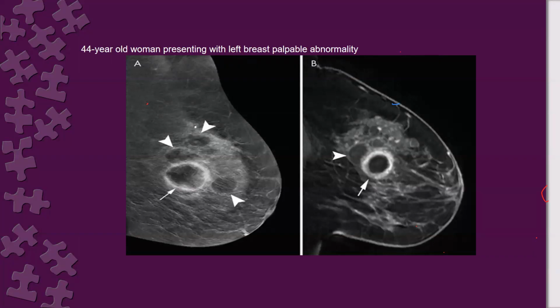This is MRI. Who said MRI? Yes, it's MRI. Who said contrast MR? Tasneem, or whom is talking? Yes, it's me, Dr. Tasneem. You are welcome, Tasneem. Which one is MRI? The right image. The right image is MRI, excellent. And the left one? It's contrast enhancement. And this is for the same patient. Look at this, for the same patient.